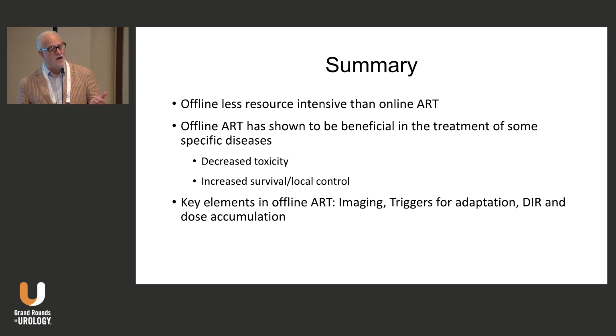So, summary: offline is less resource intensive than online. Offline RT is shown to be beneficial in the treatment of some specific diseases. Decreased toxicity, increased survival, and local control is the goal. Key elements in offline are imaging and triggers for adaptation.